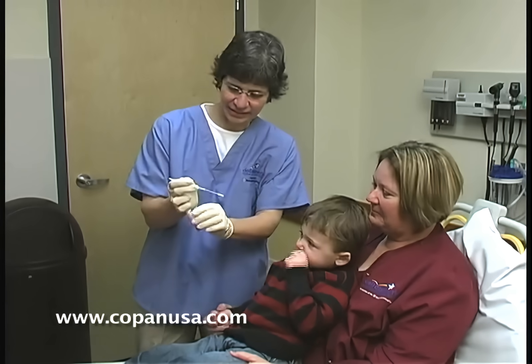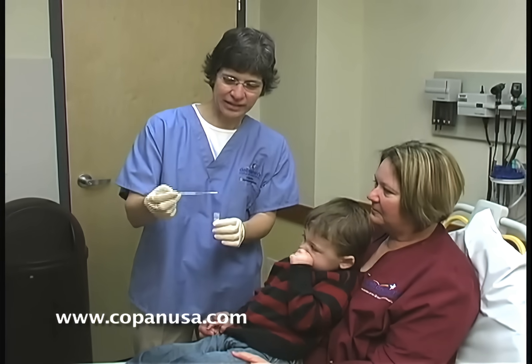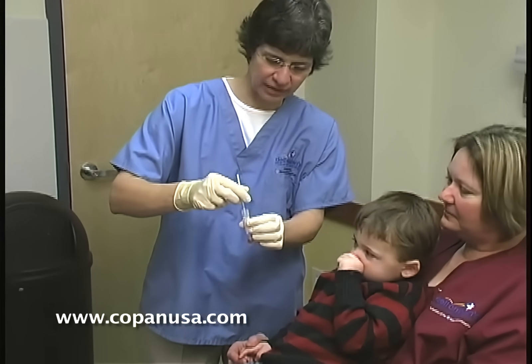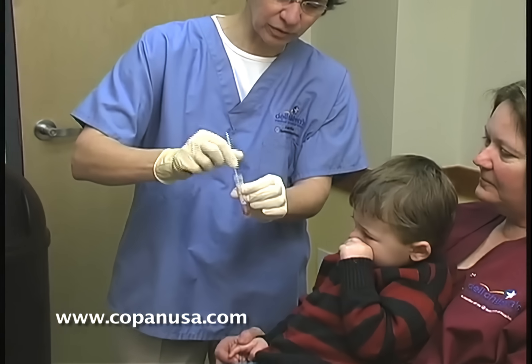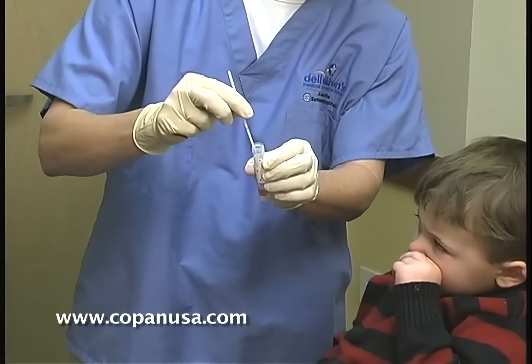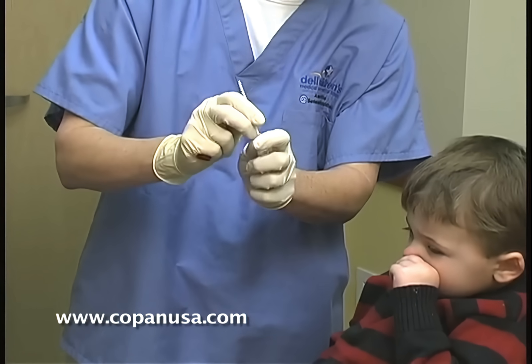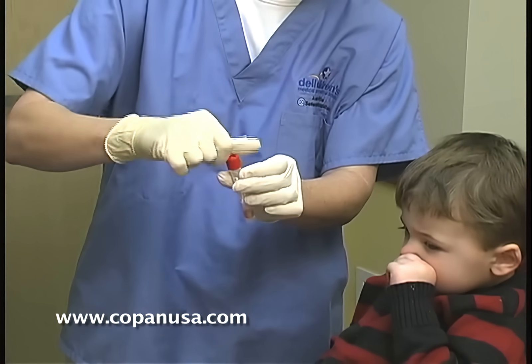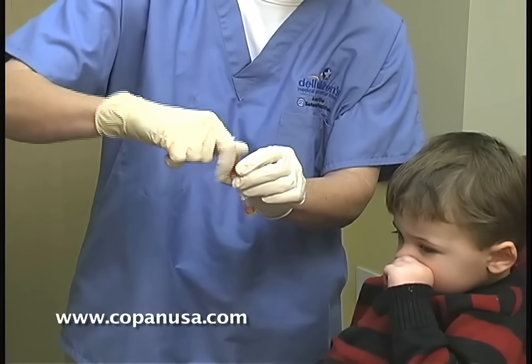You're going to take the media. You can either take this straight to your point of care test, or you'll take the swab and I often mix it just a little before I break it off. This red-pink line is where you're going to snap it — it goes right to the top, snaps off, and then you recap, and you're ready to send it off for testing.